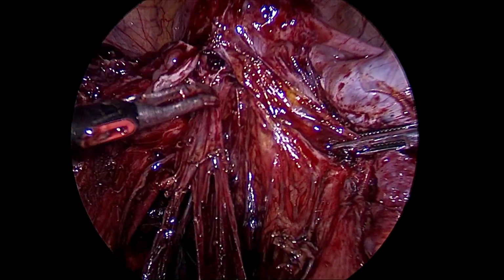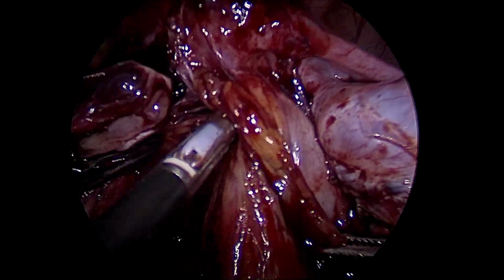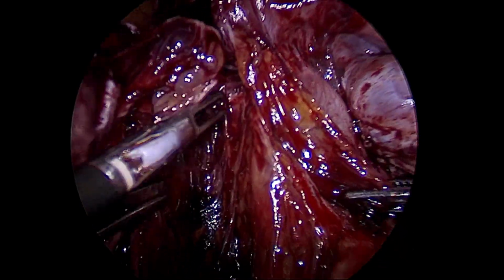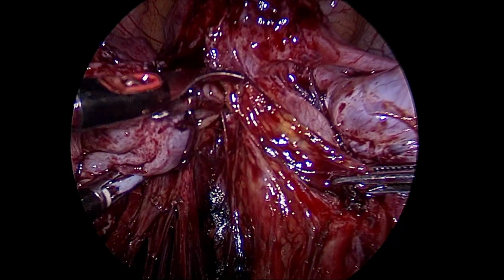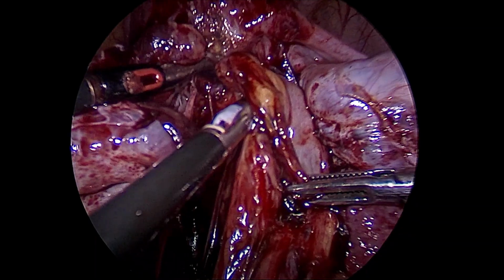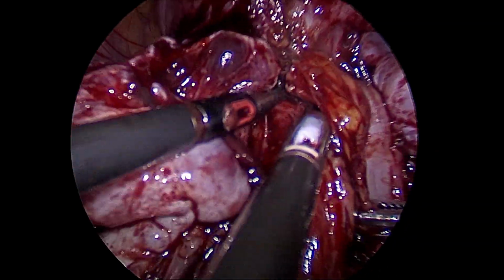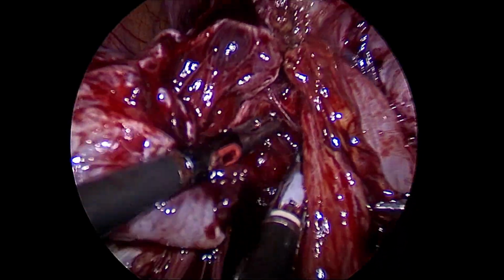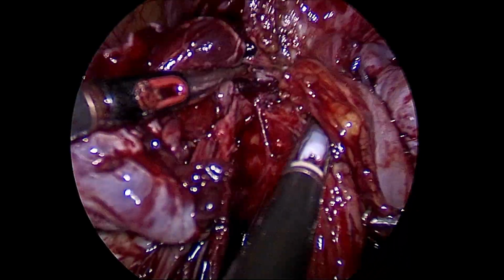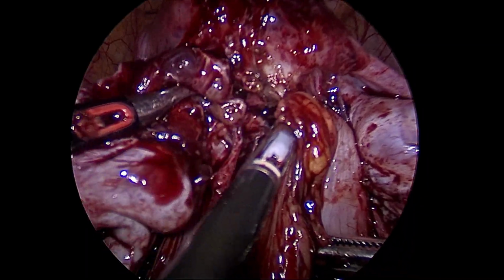So once the bowel is dissected medially, it also falls down, and these adhesions can be cut with the bipolar shearer. As you can see, this is what we are doing. We are cutting the adhesions with the bipolar shearer, and if it is done in the right plane, again the dissection and the separation is almost bloodless.